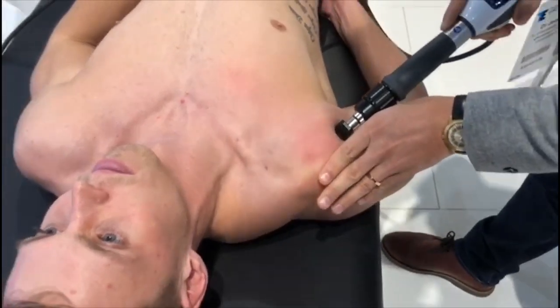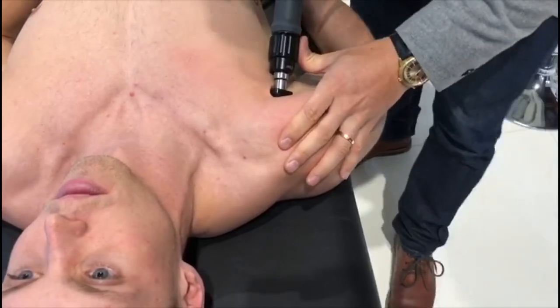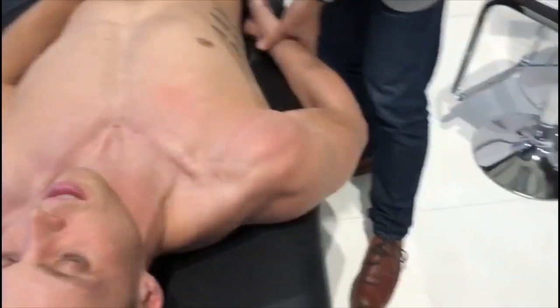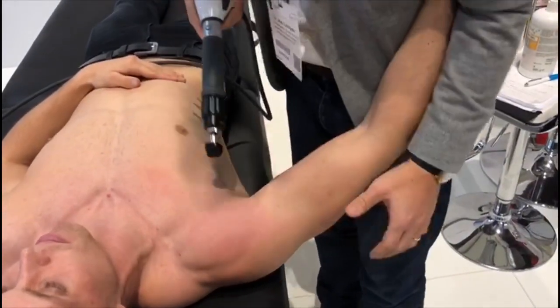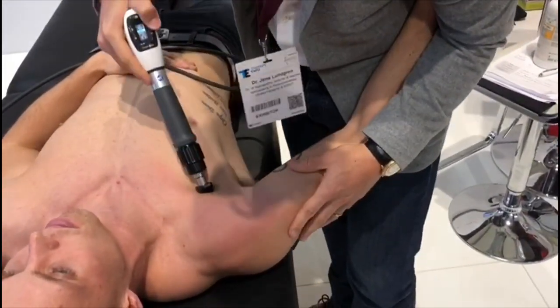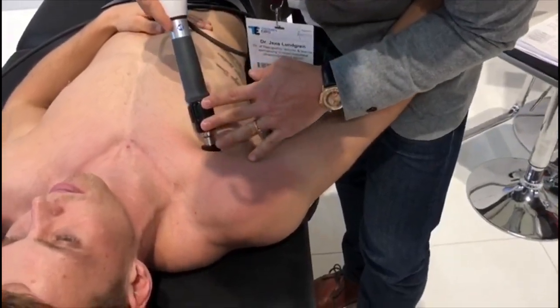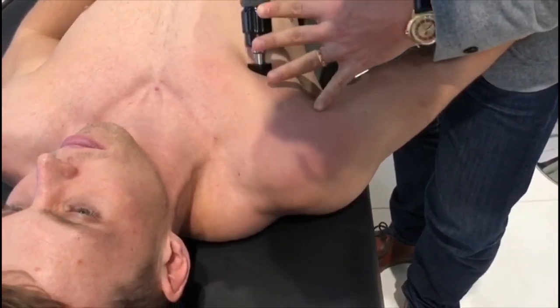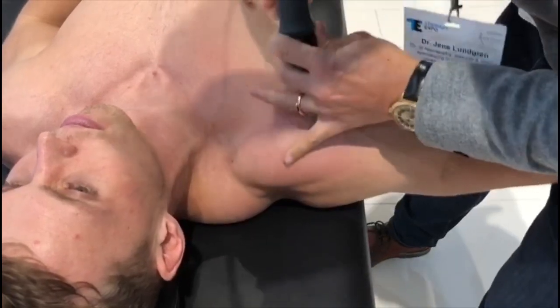So now it slides a lot better now. So that's quite a fast result. Alright, great. Let's see if this fascia as well needs treatment. So you can put your arm just like that, and I'll just squeeze it like this, and I can work in this direction. This slides really nicely. Let's see if I work a little bit more up here.